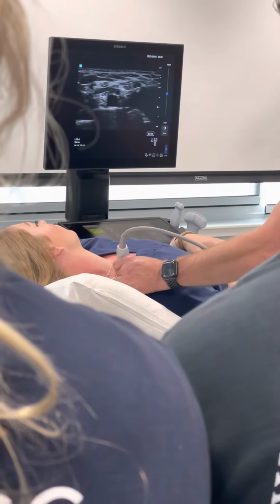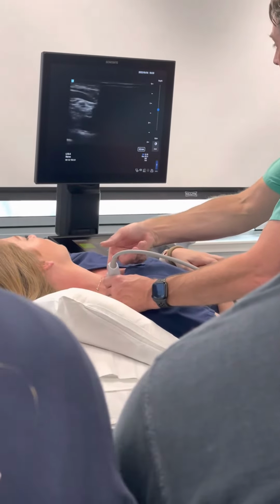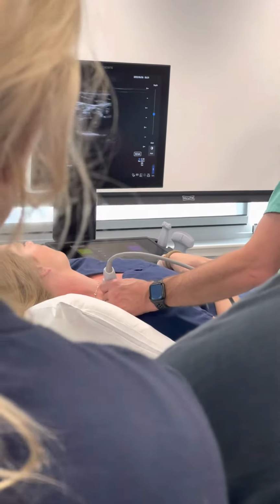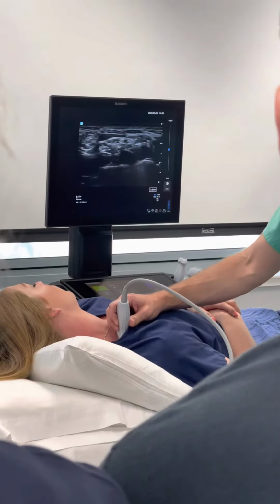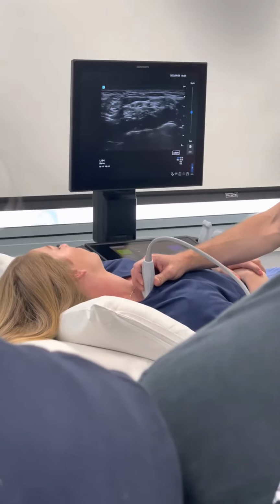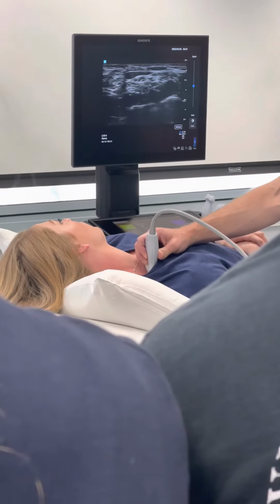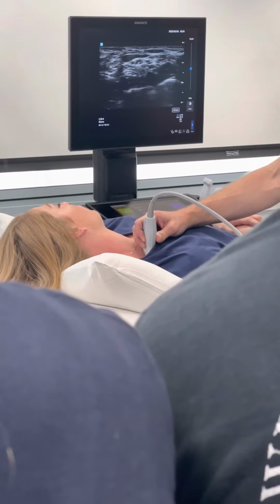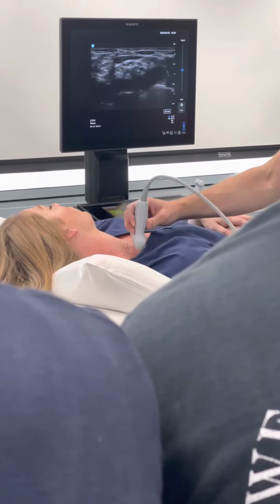And that is what we're looking at here, because if I come back here and I touch the right side of the probe, again, we can see the right side of the screen in that orientation. So one of the important ergonomic things when I'm teaching you all how to do blocks is that if I'm standing here and I'm going to do her supraclavicular block right here, I'm going to be having the probe in my right hand, my needle's going to be in the left hand. So if my needle's in the left hand, I want the needle to come in on the left hand side of the screen.